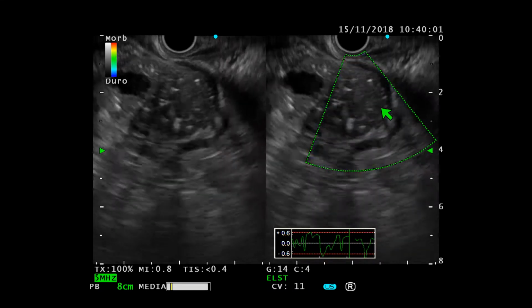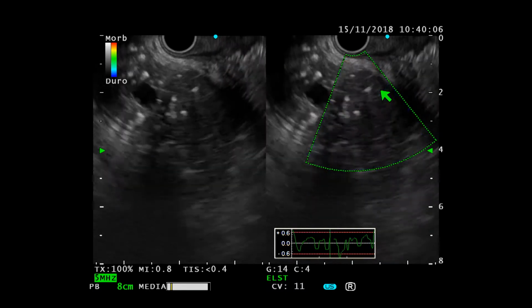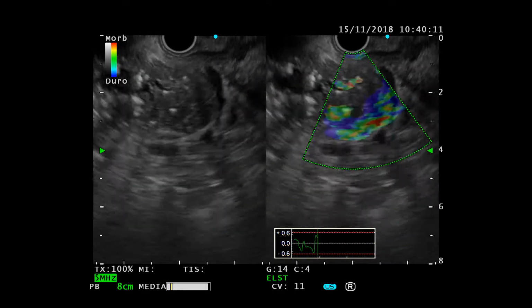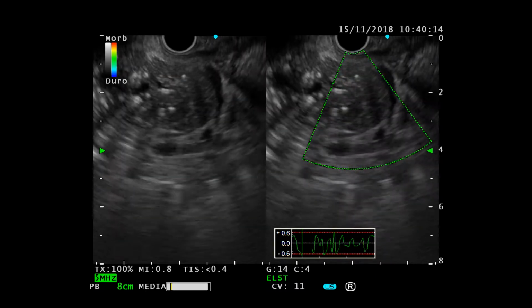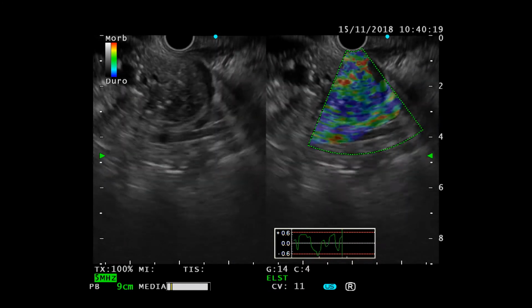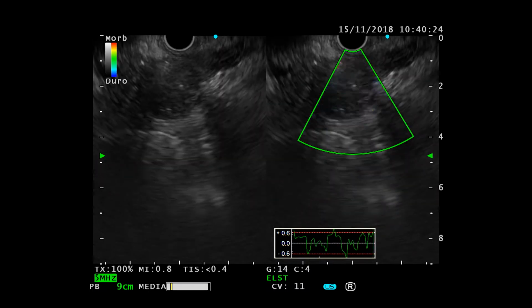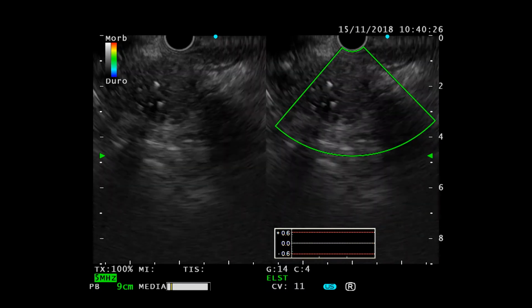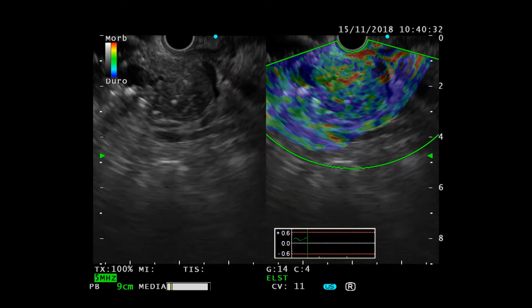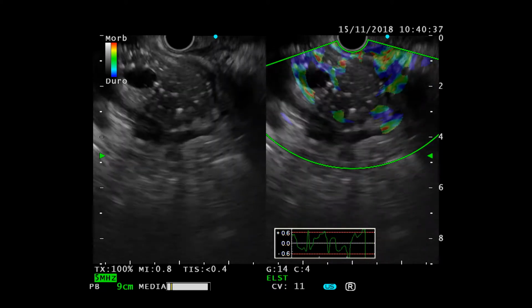So we've got Pietro here who's going to give us his opinion. It's not so blue. Can you open the microphone of Professor Fusaroli? Thomas, are you able to do a strain ratio on the Olympus equipment?